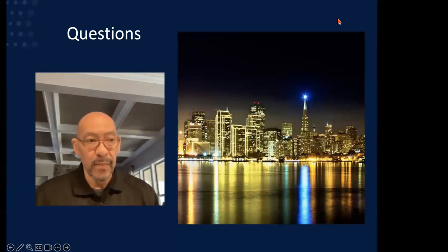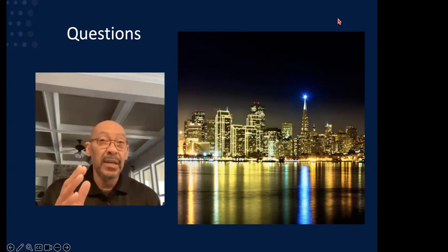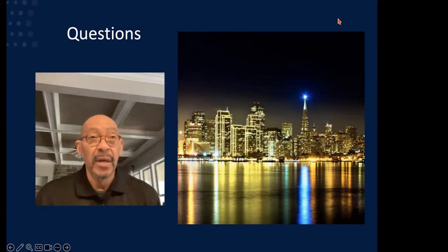We had another question. The question was, for the Bionic lens, how does it adjust the focus for the eye for near and far distance and for different imperfect vision issues? Okay, so I'm going to use a very crude analogy of a camera that has autofocus on it. When you point that camera at a distant object, the lens will move in and out. When you point that camera at a close-up object, that lens will move in and out. That moving in and out is the autofocus capability of a camera.